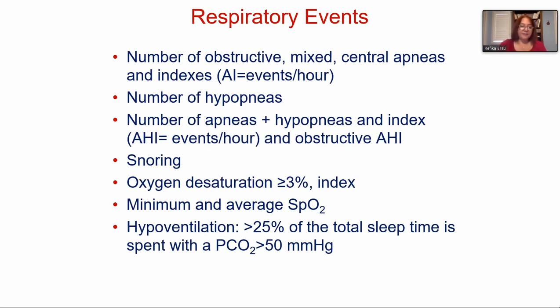And hypoventilation is defined as greater than 25% of the total sleep time spent with carbon dioxide greater than 50 millimeters of mercury. And in the question it was 5%. And this definition is also questioned and challenged by the French team.